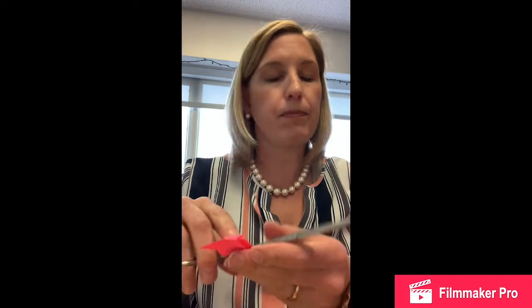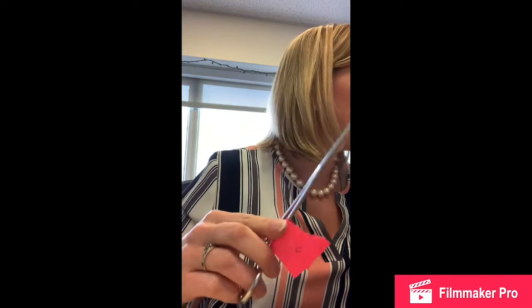The next instrument here is number F. This is a Kelly clamp. This is actually a longer Kelly. There are shorter Kellys too, but you can see that on the inside there are some kind of grippy serrations there, and that this is a blunt end. This is a nice clamp. Most of the time you'll see it used for cutting and tying across mesentery. So when we're clamping off those vessels along the way and tying underneath, they're very useful in that regard. So that's a Kelly clamp.